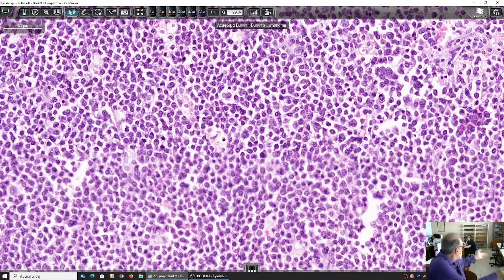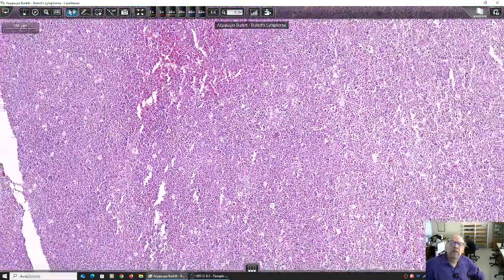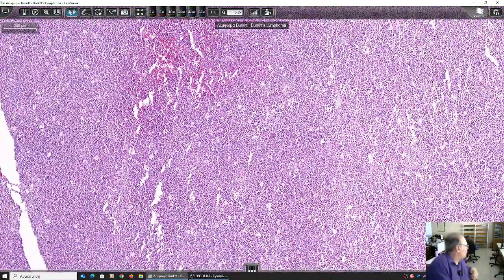Yes, this is not the pleomorphic nucleus that we saw in the Hodgkin lymphoma giant cells. So, what are these? These are macrophages, and they phagocytose. What do they phagocytose here? The apoptotic bodies. And what does it make? What does this feature now look like?